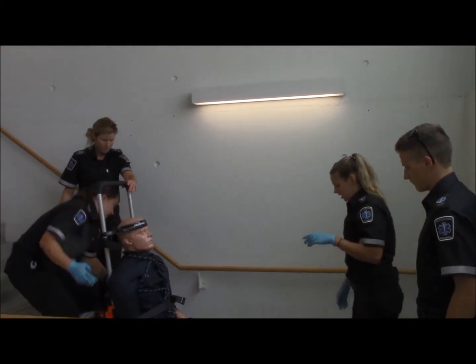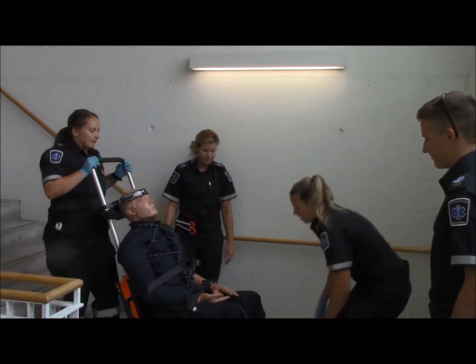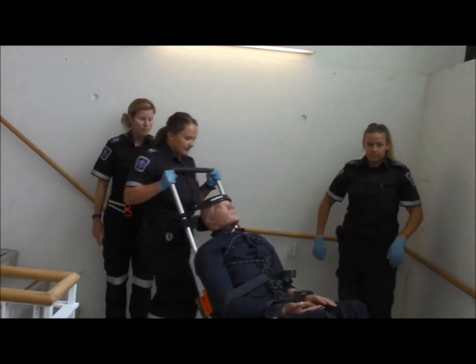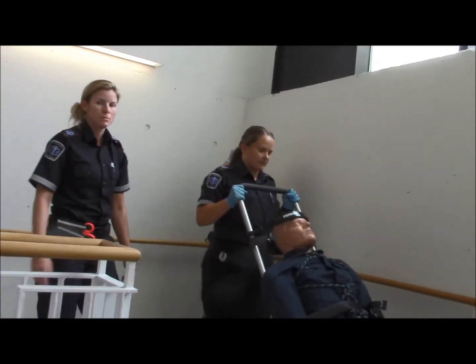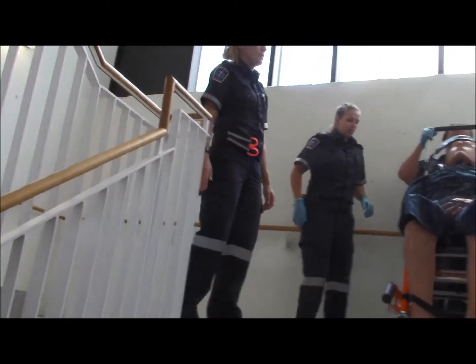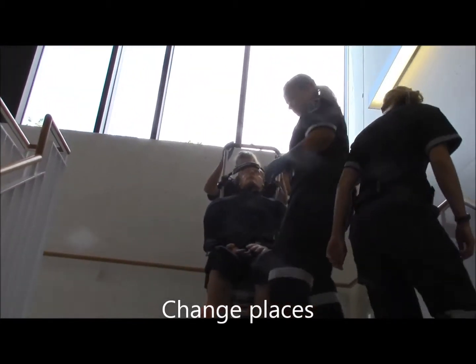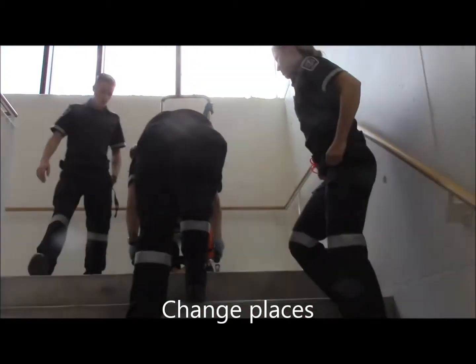It's important to note at this stage that if you're going to use all four wheels to roll the stair chair, you have to put the foot handles in because of the angle of those handles when they come out. So if you want to use four wheels, make sure you put those in. In this case, the students chose to use two wheels, and they're just tipping the person back, or the mannequin back, and getting ready for the final descent.